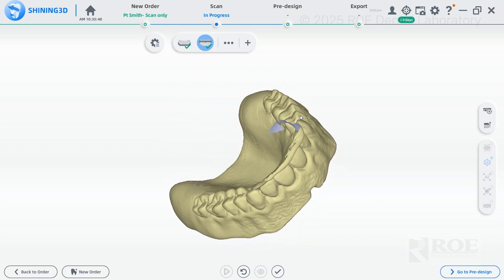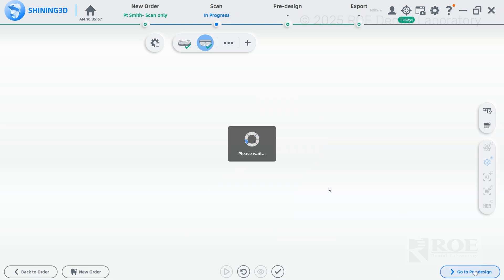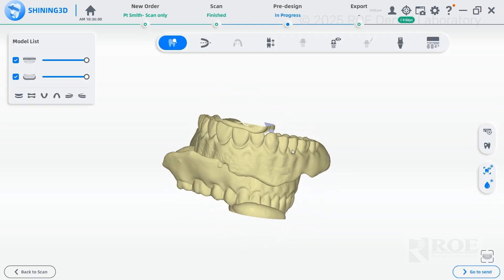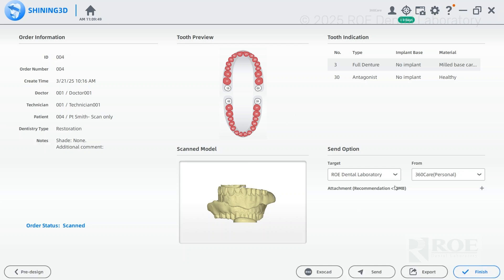Take a look at the denture — I like what I see. Go to pre-design; you'll have both the upper and lower denture scans. You can go to export to take a look at everything one more time before sending it to the lab. After you finish the order, you'll see the drop-down menu to send it to the dental laboratory. Select the lab and send it — and you're done.